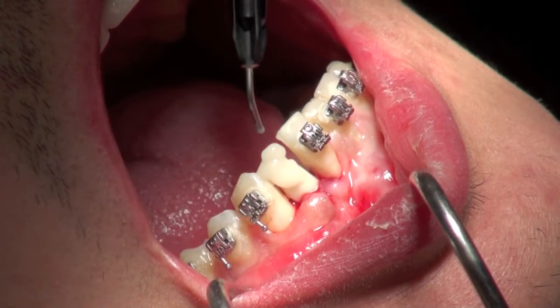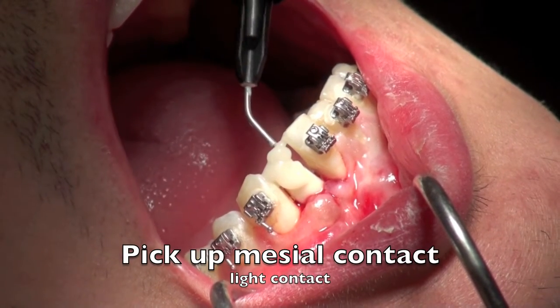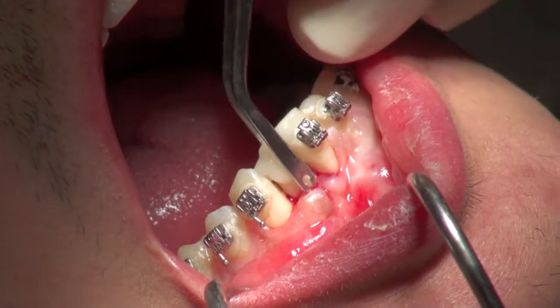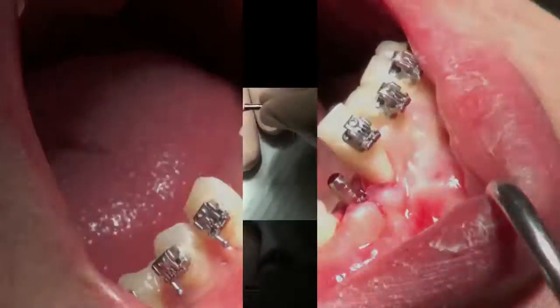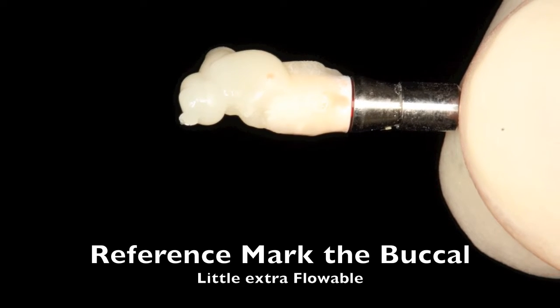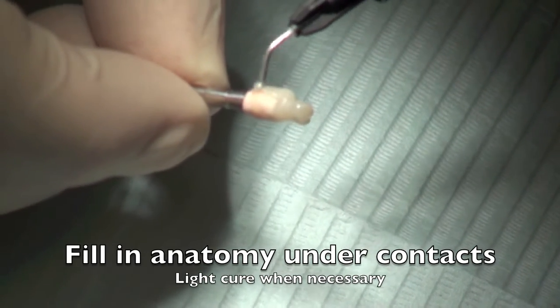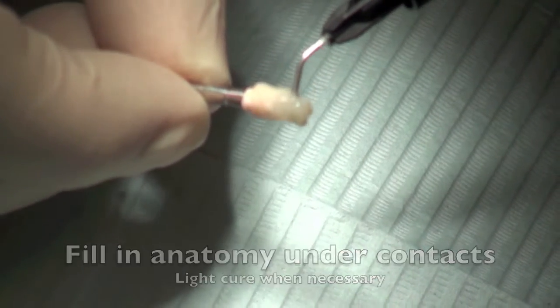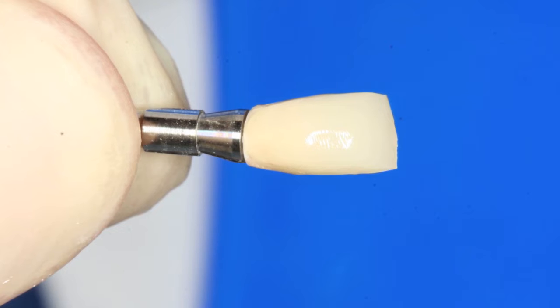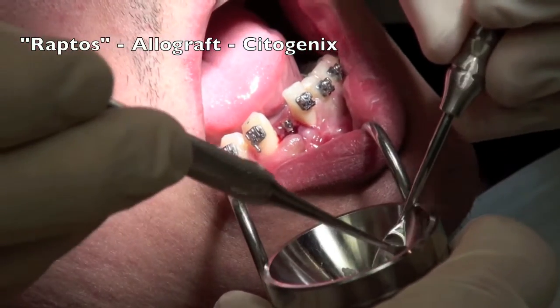The light curing is done rapidly — I like the rapid type of lights, the five-second cure. Here I pick up that last mesial contact, which enables me to know the shape of the tooth once I pull this out and put it back on the replica with the immediate temporary abutment. You have to have two immediate temporary abutments to do this: one for the replica and one to stay in the mouth. I'm building it out with the flowable resin, adding a little bit here and there, and this is going to bring out the shape of the tooth, creating a very beautiful temporary which smooths out very quickly. You can add a little bit of bond to make it look smooth.